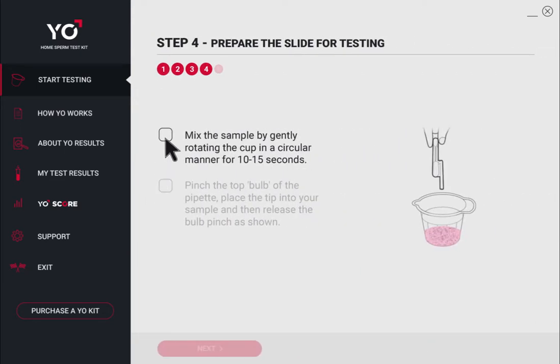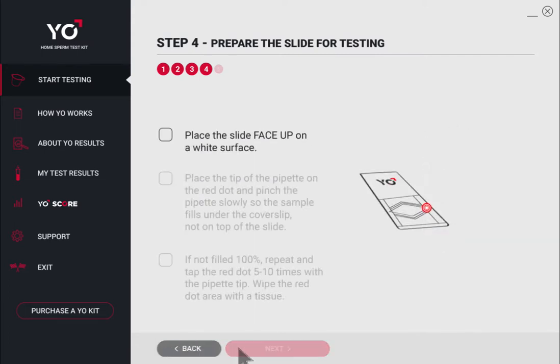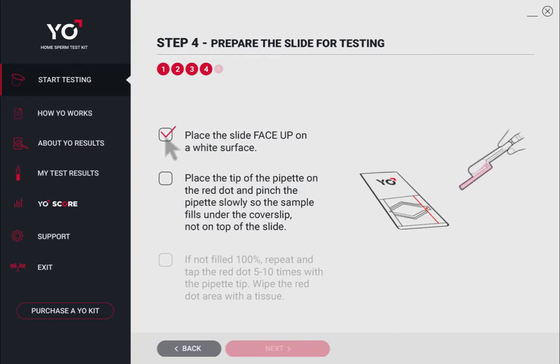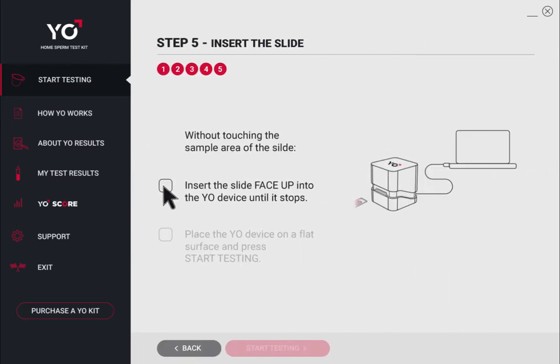When the timer goes off, mix your sample. Next, pinch the top bulb of the pipette and place the tip into your sample. Release so your sample will fill the pipette as shown. Find the red dot on the Yo slide and place the tip of the pipette on it. Pinch the pipette slowly and watch as your sample automatically fills the triangle under the glass cover.